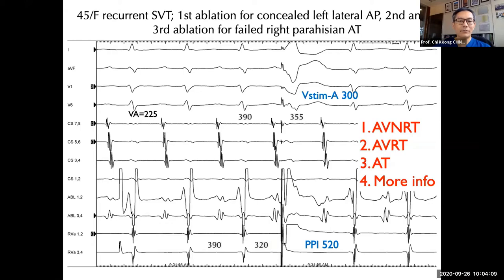EGM, the critical EGM that we managed to record and observe repeatedly in the EP lab. Take some time to think, look through this, and what do you think the diagnosis is? Is this AVNRT? Is this AVRT? Is this an ATAC? Or we need more information? Let's poll.